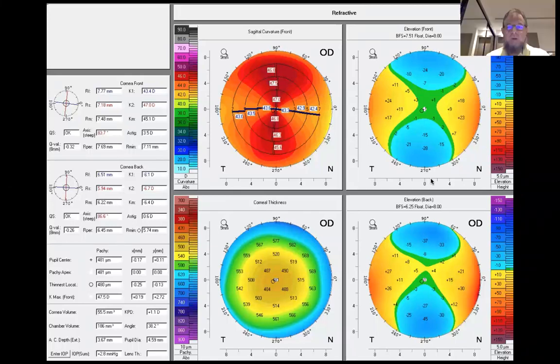Yeah, sometimes, up to 60 seconds. Of course, I don't do PRK over the flap too often, because I have to check the thickness of the flap, and that the stroma of the flap is sufficient to take off the refractive error without ending up at the interface. I don't want to ablate the whole flap at the end.